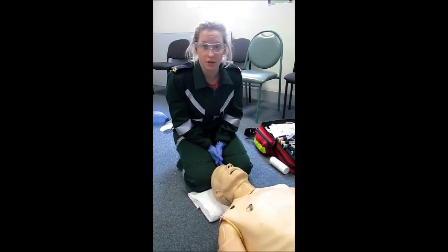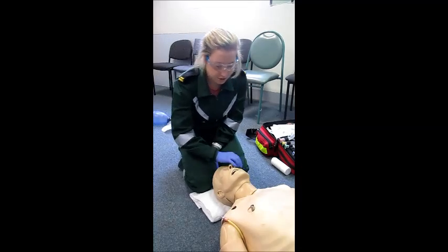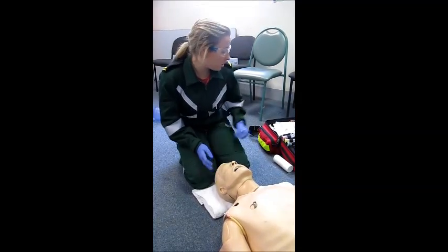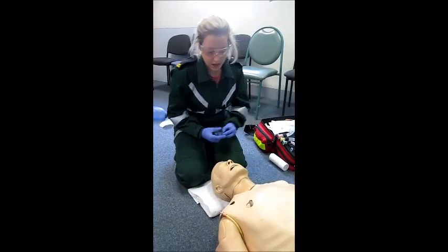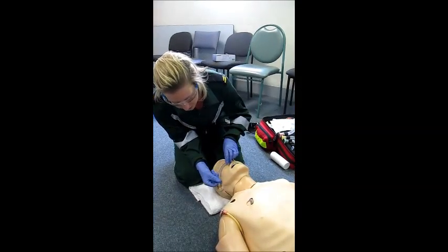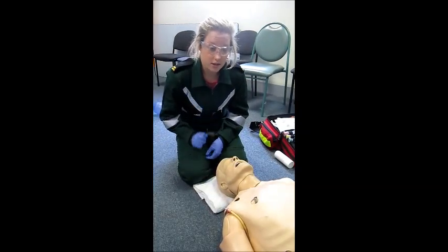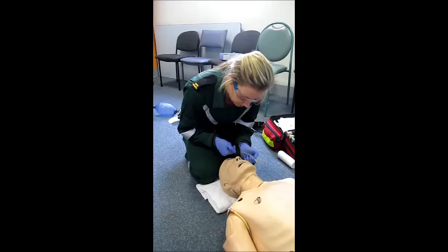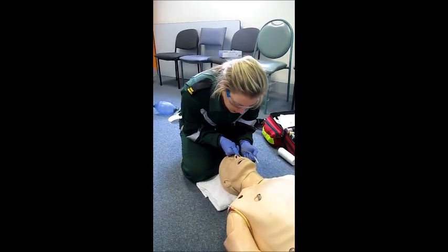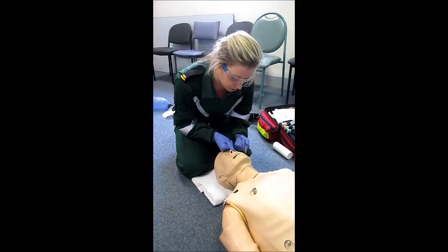I will now demonstrate the insertion of an NPA. NPAs are used in unconscious patients with trismus. They are not used in patients who have mid or lower third facial fractures or significant nasal trauma. A common error is using an inappropriately sized NPA, so we measure it from the nostril down to the earlobe. I have lubricated this to aid insertion as well. I'm going to visually inspect the nostrils, looking for any obstructions, and then choose the largest nostril.